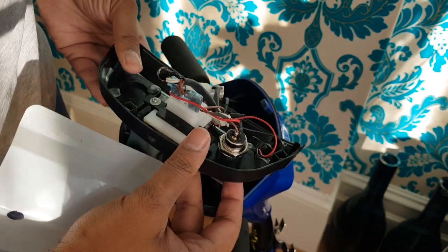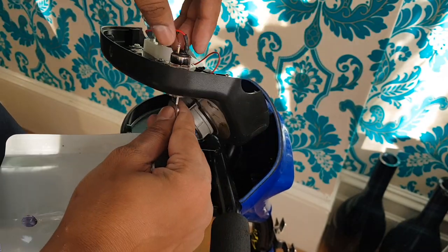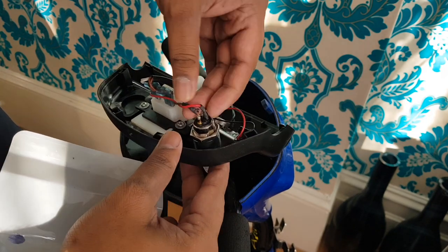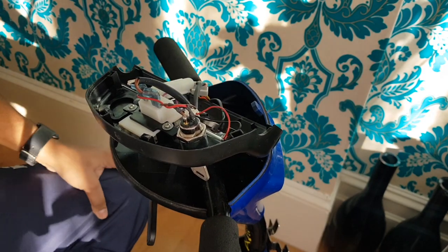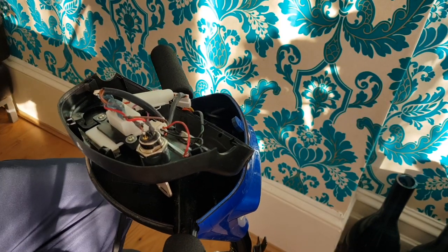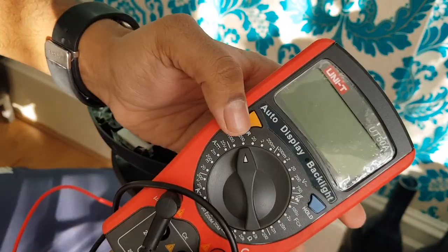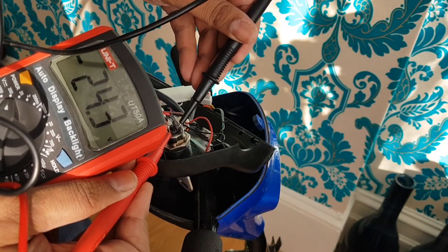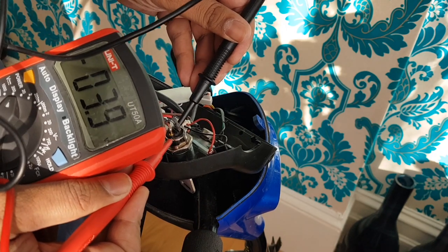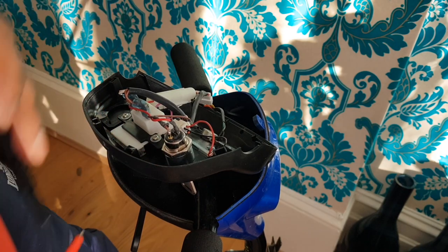Trying to get a good angle so you guys can see what's going on. This is the key area — you can see the key there; it's a bit loose, slightly exposed. What we're going to do is test to see if this key is getting power using a little tester. Let's fire this up and see if the key is getting any volts. One probe on there — 24 volts. So the key switch is actually getting power, but the key is not firing us up.